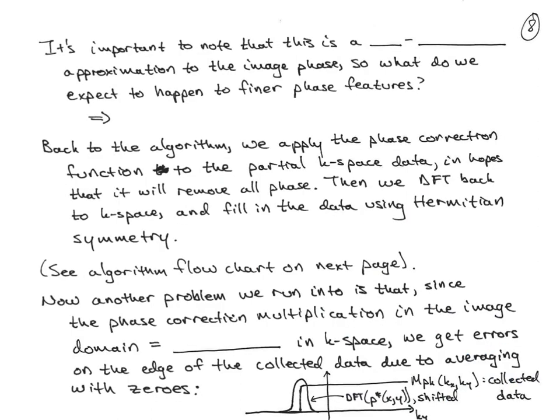It's important to note that this is a low resolution approximation to the image phase. So finer phase features will be partially lost. That is, what we expect to happen to them is that they will not be fully brought back into the real channel of the image.